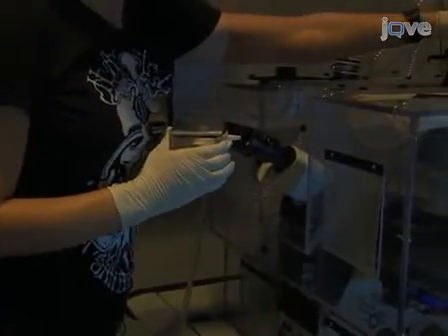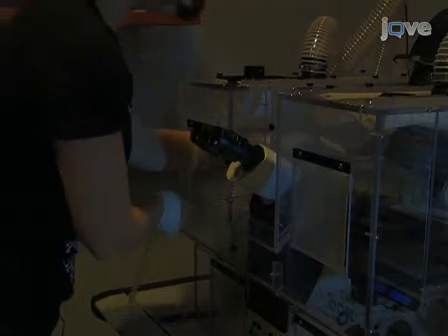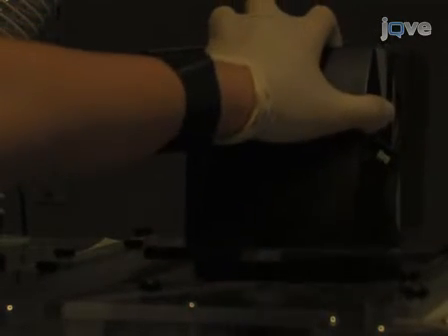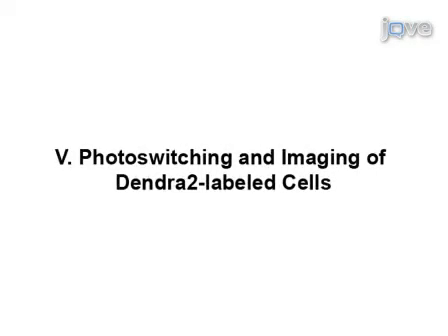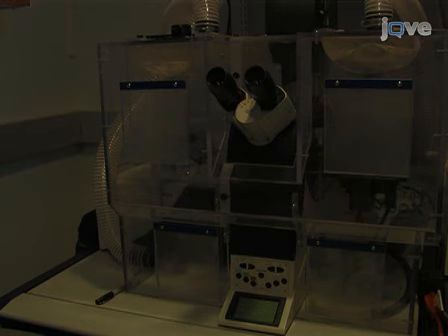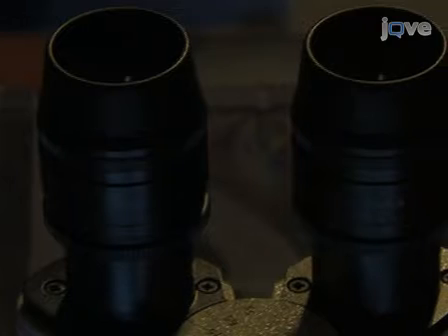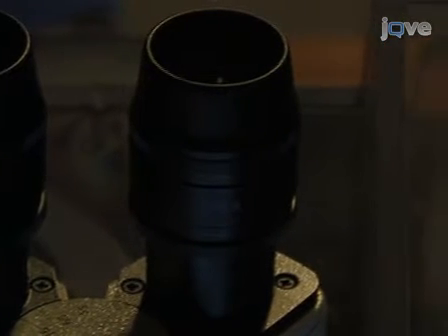Lower the microscope objective to allow space to put the box on top of the microscope stage. Adjust the stage so that the MIW cover slip is above the objective. We can now focus the objective and start imaging. The imaging procedure described here is for the Leica SP5 confocal microscope and should be used as a guide to optimize the experiment with the particular microscope being used.